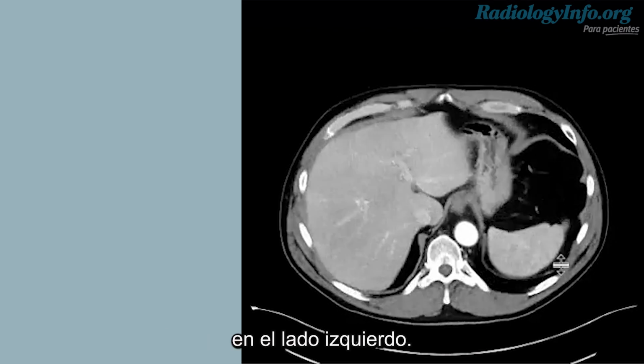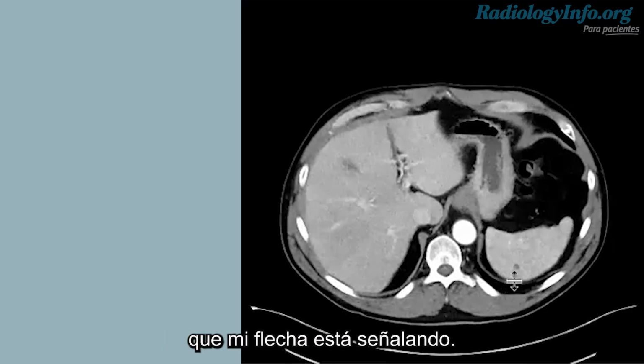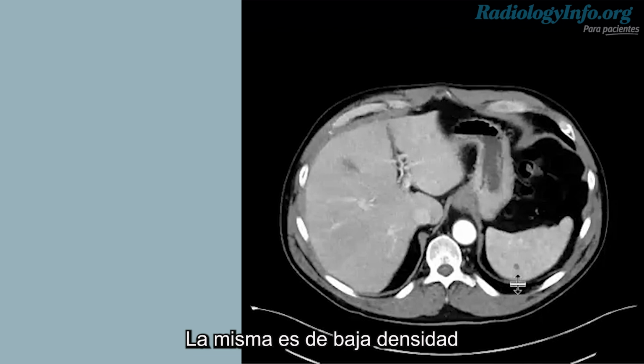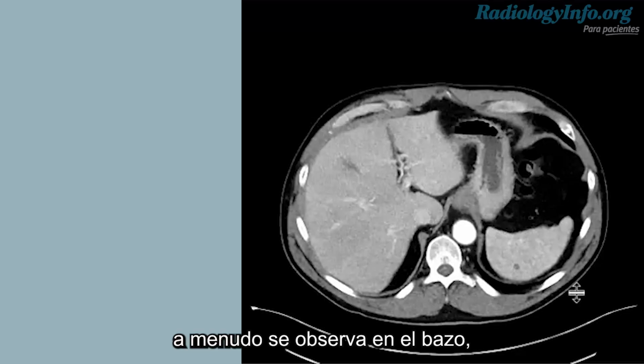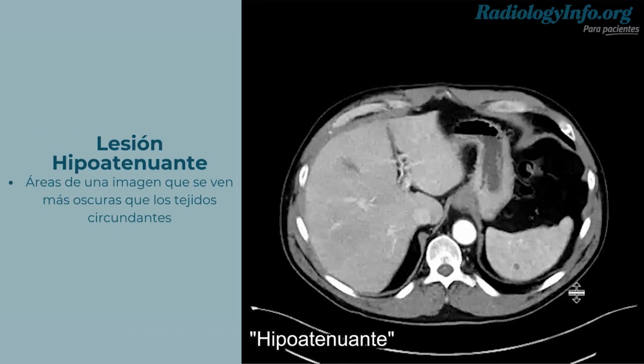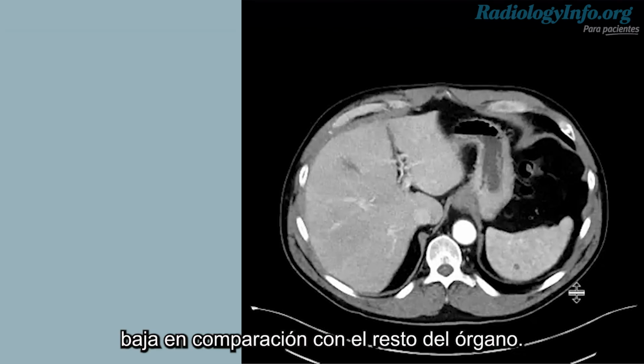This is your spleen on the left-hand side. You'll see here a very small lesion where my arrow is pointing to that is lower in density compared to the rest of the spleen. This is a very common finding that we often see in the spleen, the liver, or the kidneys, and we call this a hypoattenuating lesion. Hypoattenuating just means it's lower in density compared to the rest of the organ.